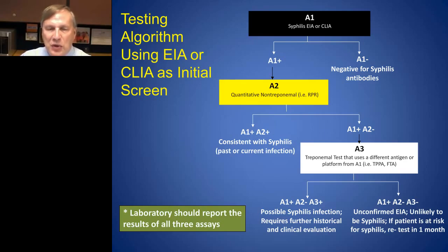So there needs to be more guidance, and we're going to talk about that more guidance in just another couple of minutes. One thing to remember, no matter what algorithm you're using, if you're using multiple assays, in this particular case, the laboratory should report the results of all 3 assays. I have to get in our regulatory end. If we do 3 different assays, we're obligated by our regulatory agency to report the results of all those 3 assays too. So that's one thing to remember.